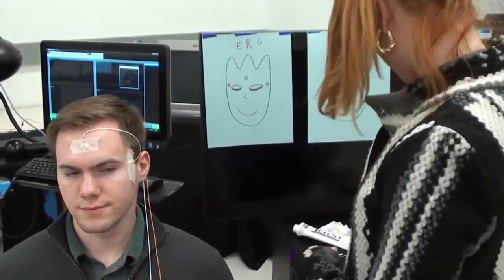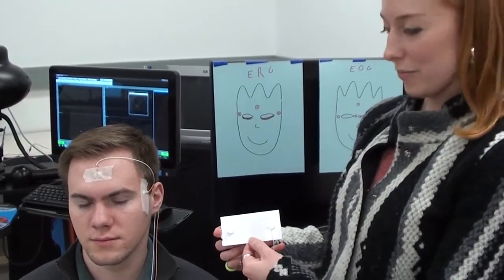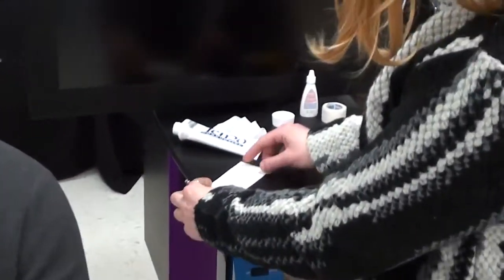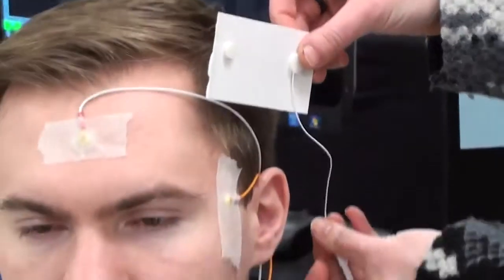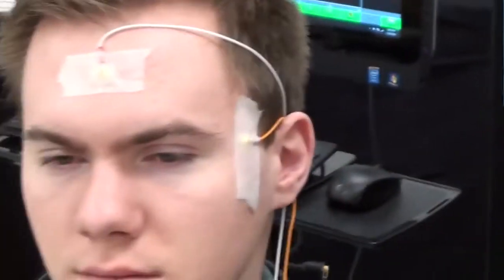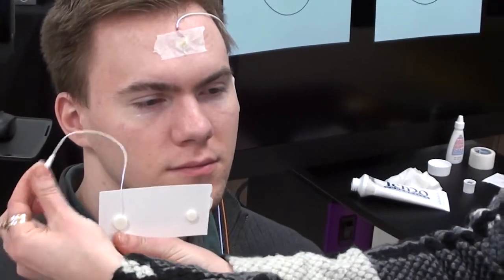Now we're ready to put the left eye DTL on. To apply a DTL, we use a firm surface to peel off from both sides, remembering that this tail is going to tuck behind the ear. So if you're doing this side, it goes like that, and if you're doing the other side, it goes like this to tuck the tail behind the ear.